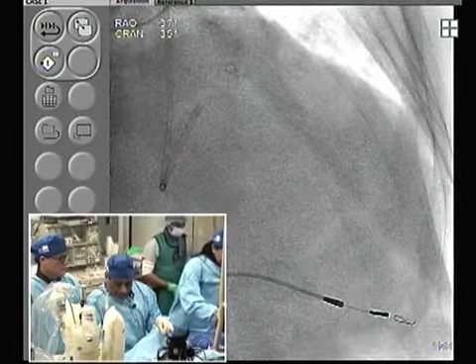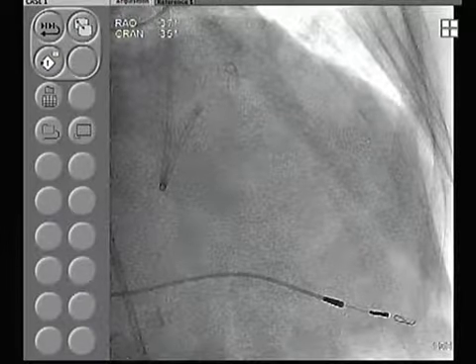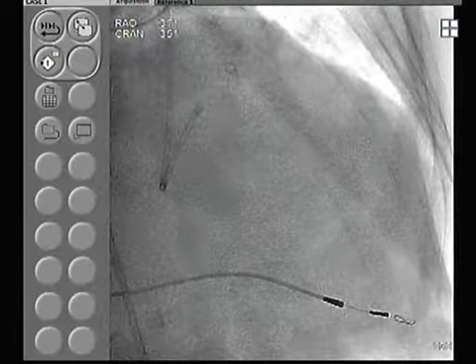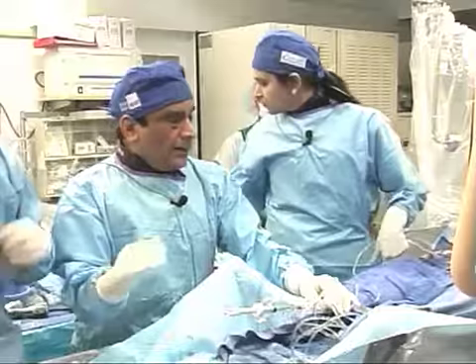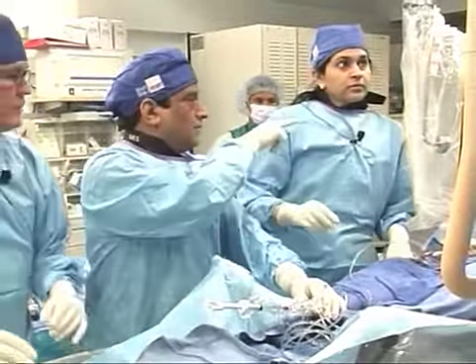So if you can get the same job done with the smaller burr, that is fine, because basically you need to remove that calcium. That's the purpose of the rota, to decalcify it. And therefore the question comes, do you need to do anything to the ostial diagonal with the rota or no?